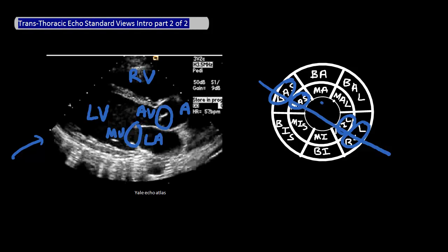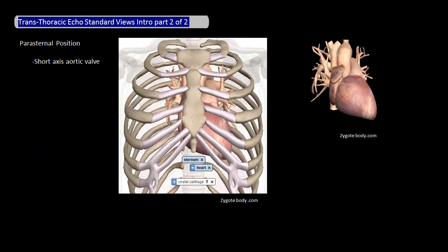The second view is the short axis view of the aortic valve, which is also at the parasternal position. If you're looking at the heart from the front, the cut across the heart is right where the aortic valve is.